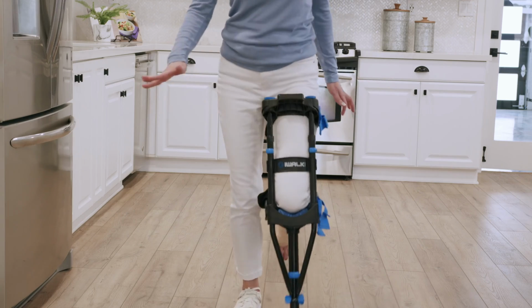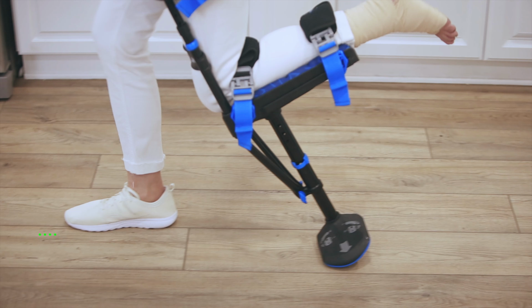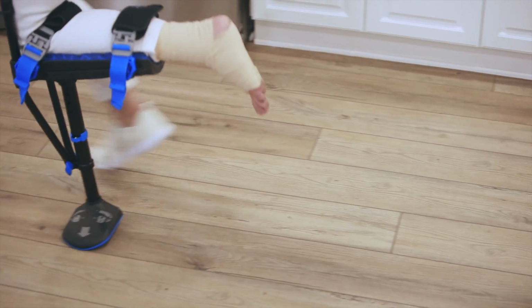This can be pretty scary, but it rarely results in a fall because their good foot is planted firmly on the ground in front of them. A small stumble or hop is usually the worst thing that happens. This condition will typically self-resolve pretty quickly.